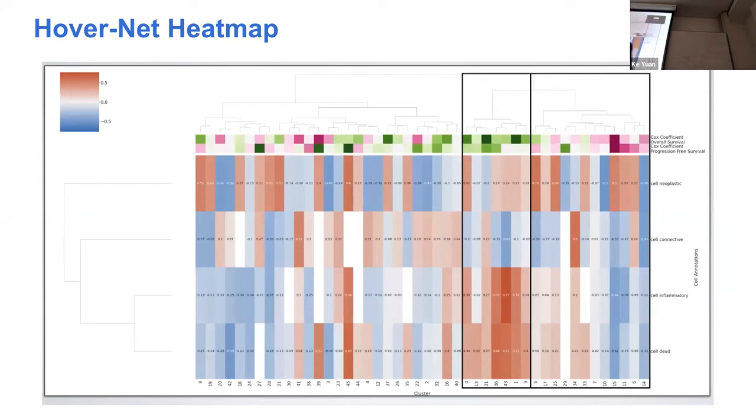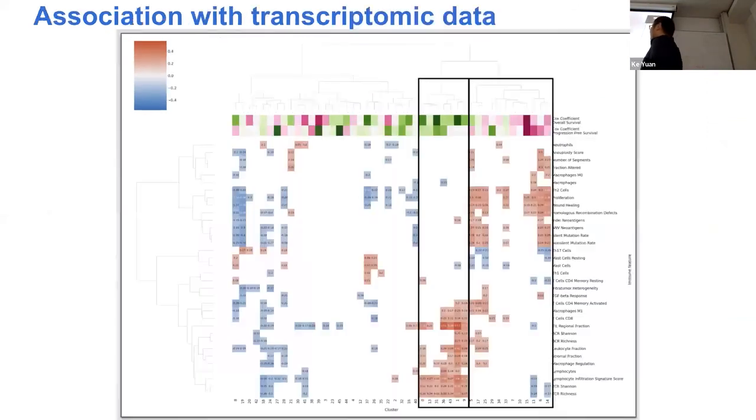You can use the test to quantify that, and you can again generate a heat map of different clusters and their association with different cell types. Again, they are color coded in terms of their hazard ratio. Purple and red mean they're more dangerous, and green means they are more okay. And then you can see there's consistency between two entirely different cohorts and two different tests.